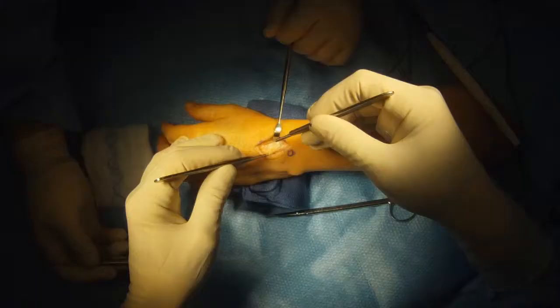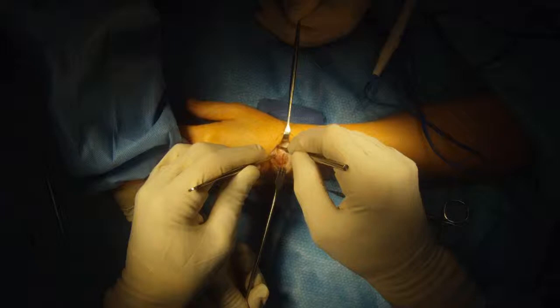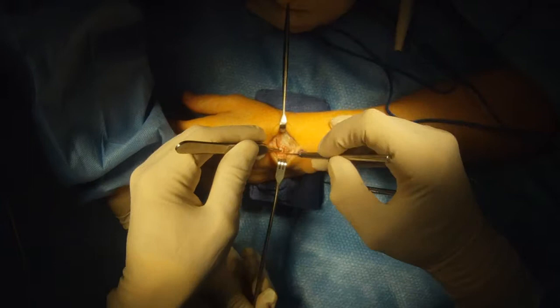See the tendons there? We're going to release the tendons from the underlying joint. Then we're going to cut through the joint in a manner that preserves the secondary ligaments.